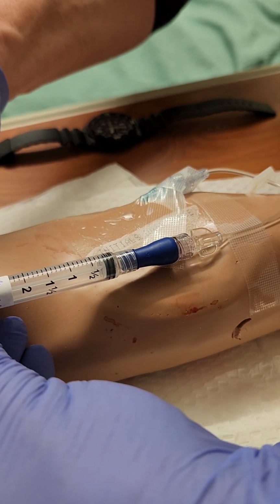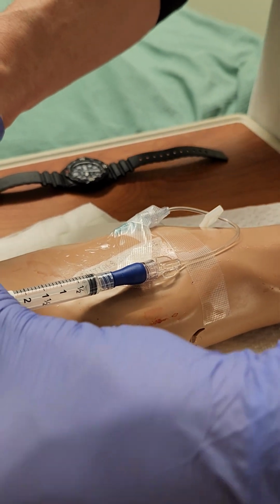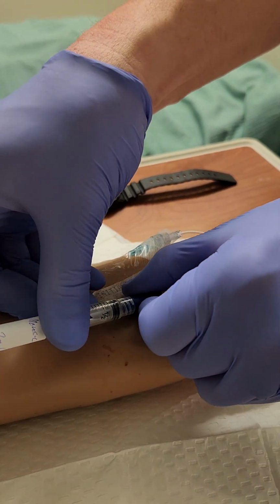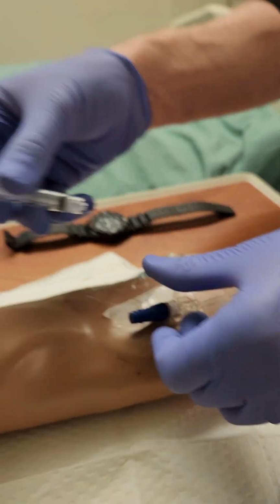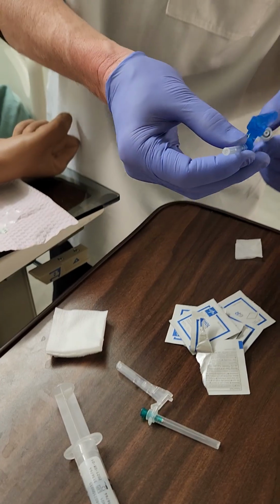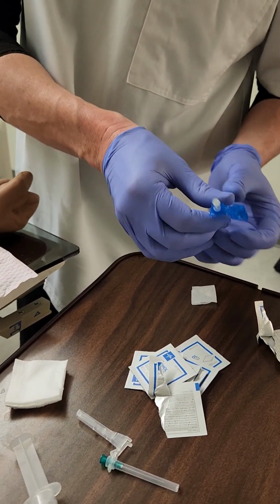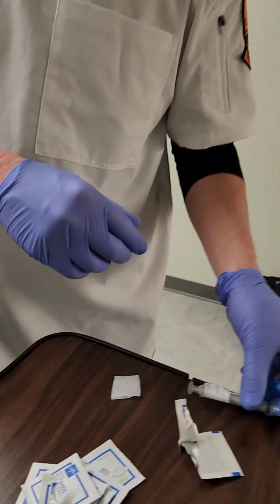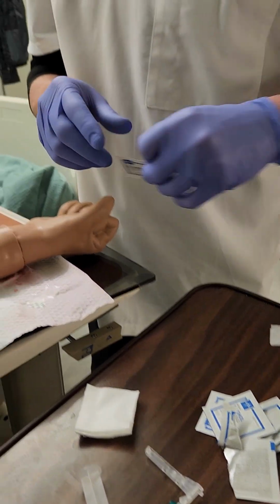All right, we're over 4 minutes, and we're just finishing up. Boom! How you feeling? You feel a lot better, huh? That's good. I take that off. All right. So now I'm gonna put this back on here. I can go ahead and set that. I would just put that in the sharps container, and then I'm gonna go ahead and clean this off.